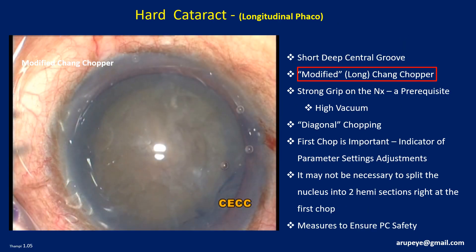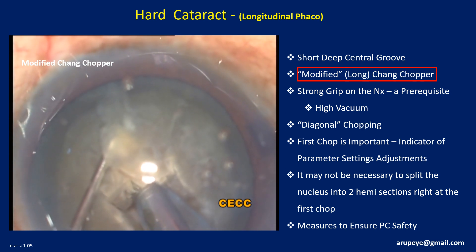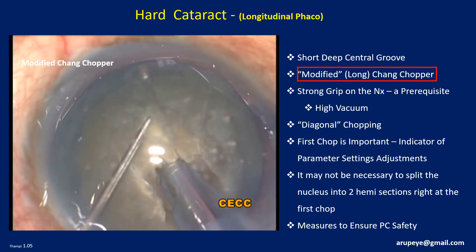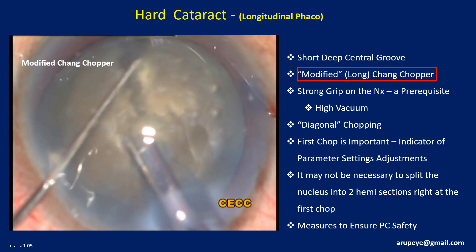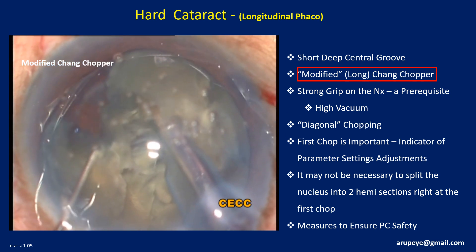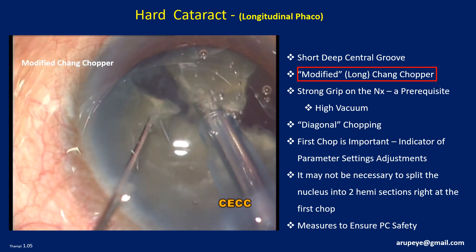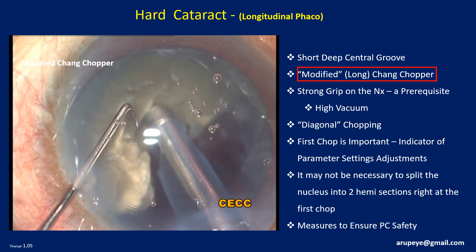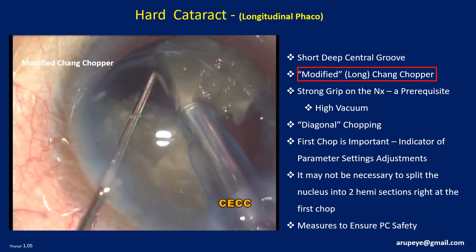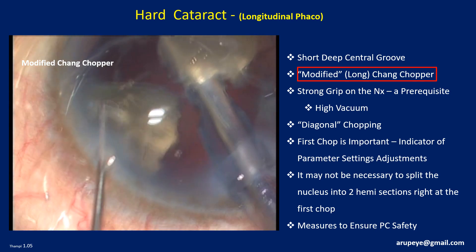In this case, phaco is initiated with sculpting a short deep central groove. The phaco needle embeds at the deeper aspect of the distal wall with high vacuum settings. As there is a tendency for nucleus dislodgement, the needle is driven deeper into the nucleus with a further buzz of phaco power. The nucleus is now wet-stabilized and chopping is easily done. The chop line is extended centrally by working at a deeper plane. The nucleus is sequentially rotated and the chopping sequence is repeated till the entire mass is split into multiple fragments. Parameter settings will be reset for fragment consumption at lower vacuum and relatively higher aspiration flow rate. More caution should be exercised towards the end of fragment consumption to avoid post-occlusion surge, which may be dangerous for the posterior capsule.